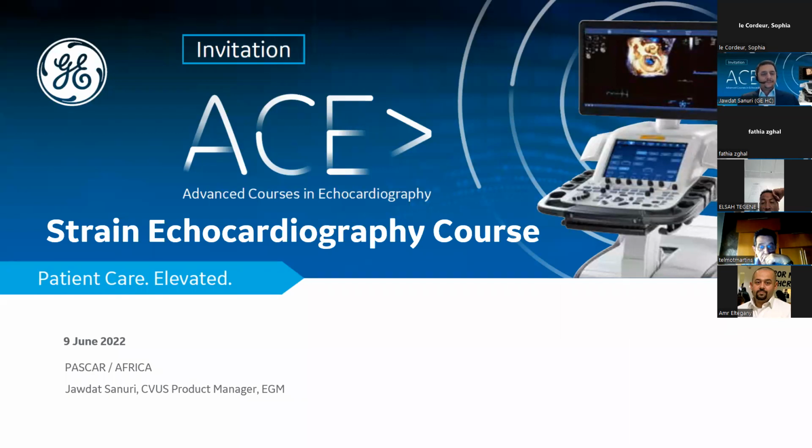Today's session is an in-depth session on strain echocardiography, where we will talk about the origins of strain, a little bit about the technology background, whether it's tissue Doppler or speckle tracking, and then we'll talk about the various strain applications that are out there, and implementing or integrating strain echocardiography into the routine echo practice.